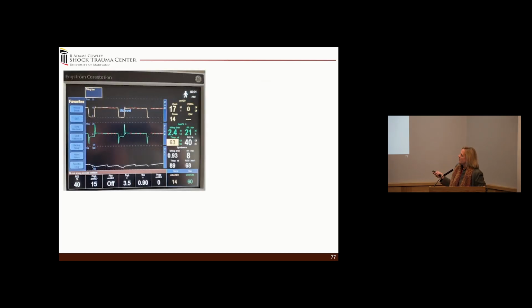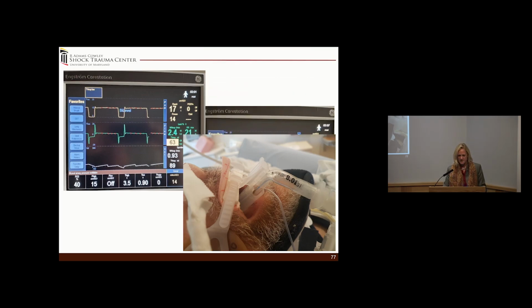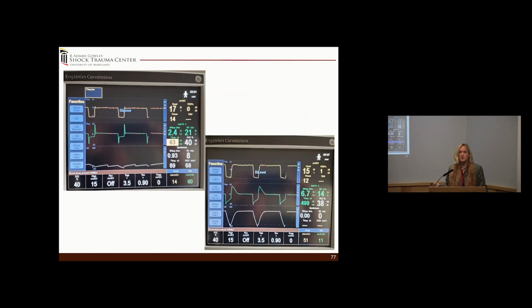So here's an example. You can see that spike, right? So we know we don't want to measure that, but look how flat that waveform is. Just imagine that you come in and you say, oh, that patient's probably a COPD patient, right? It's got that flat angle, a low peak expiratory flow rate, except you look over and you see this. Okay, so that is actually going to create that waveform. So you straighten that out and everything changes. Your peak expiratory flow rate goes up and your T-low is at a much different point. And actually that was that patient. So see how my COPD resolved immediately.